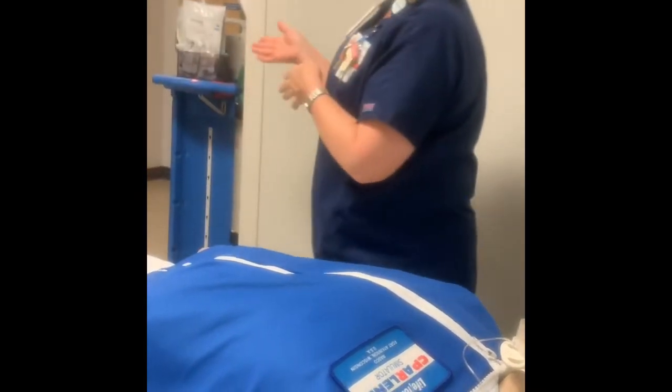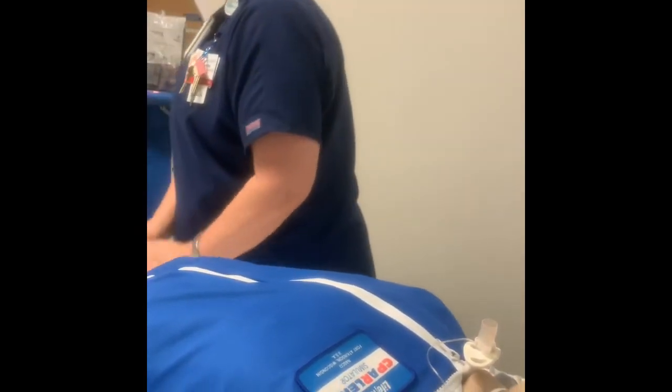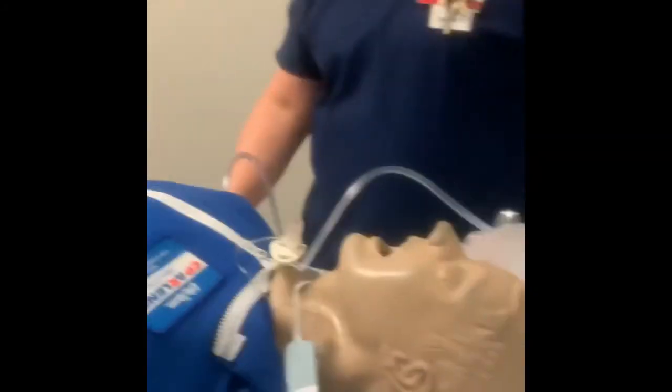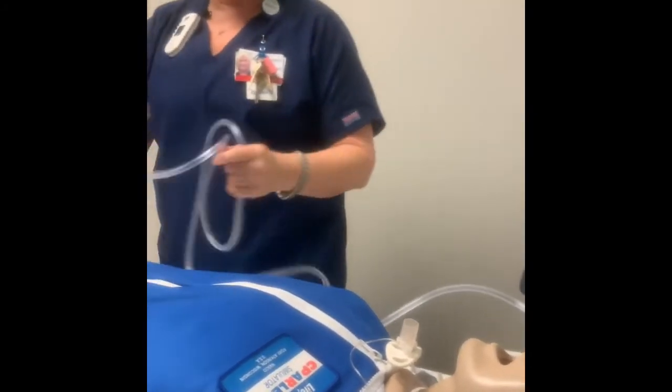Okay, so suctioning, when you suction your patient here, clinical skills is really clear about suctioning patients step by step, so you should just follow it sometime. Make sure you have your suction here. You don't want it to go past 150 millimeters of mercury. It's too much pressure on the lungs, okay?